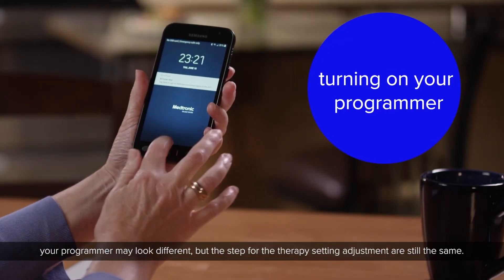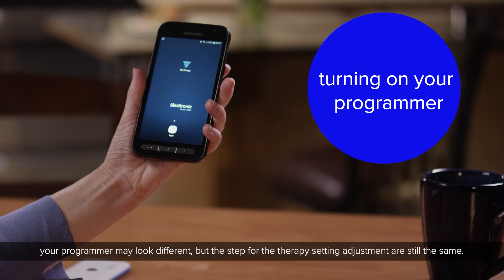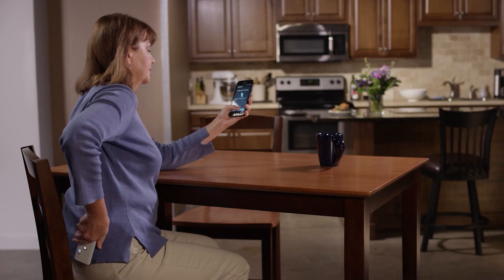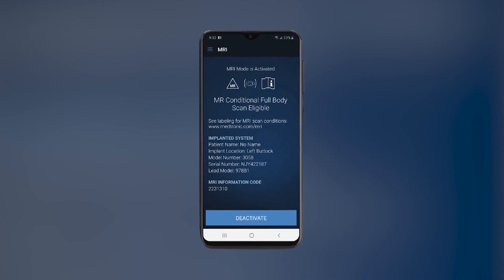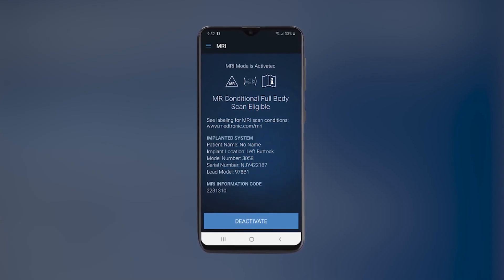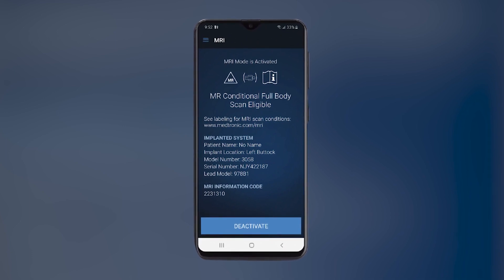Unlock your programmer by swiping your finger up across the screen and then open your My Therapy app. Once prompted, click Find Device. In the upper left corner, click on the three horizontal lines, then select MRI and click Activate to turn your device into MRI mode.